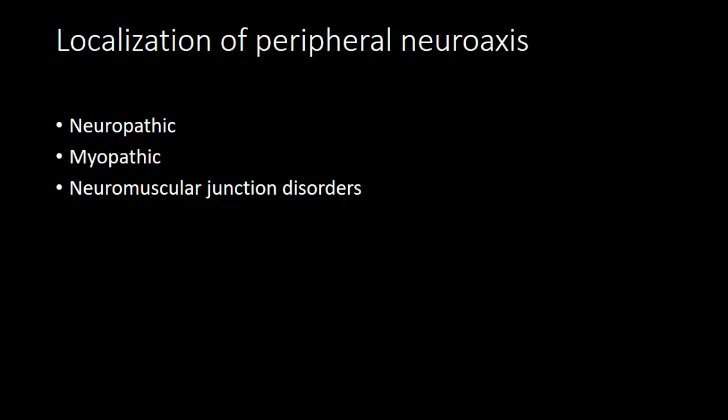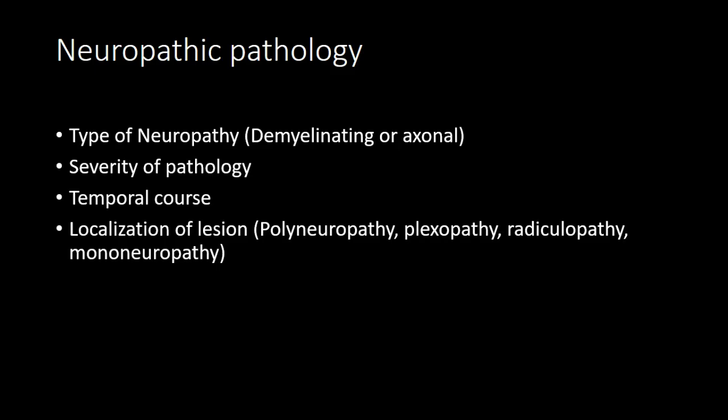Again, with the nerve conduction piece only, what you can try to get is: is it a neuropathic problem? Is it a myopathic problem? Or is it a neuromuscular junction disorder? Second, nerve conduction studies guide us about the severity of the pathology.